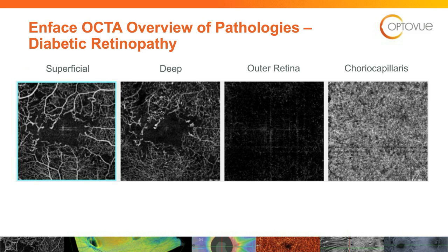Another en-face, more severe now. Those last ones were in the relatively mild to moderate stage. You take a look at these 2 on the left, and we've got severe capillary dropout, drastic enlargement of the foveolar avascular zone. There's a tremendous amount of ischemia going on. This patient's rate of likely progression is high and quick based on the capillary dropout and the ischemia that you're seeing. We know the angiogenic factors are likely going crazy with the amount of ischemia in the superficial and deep capillary plexus.